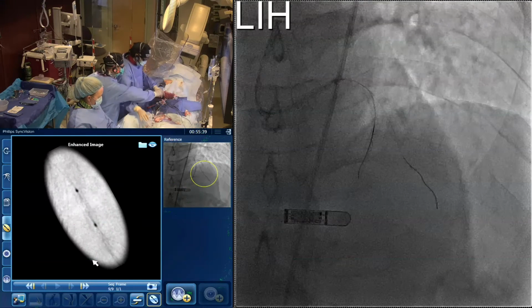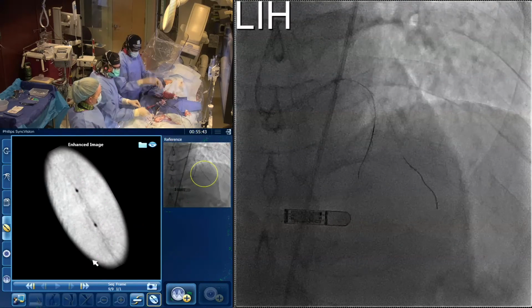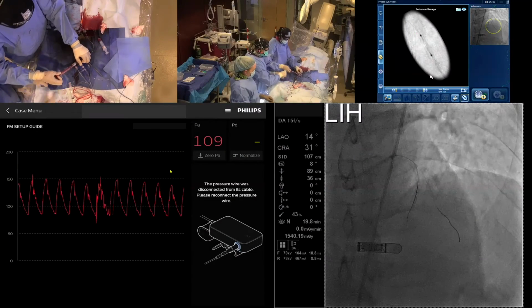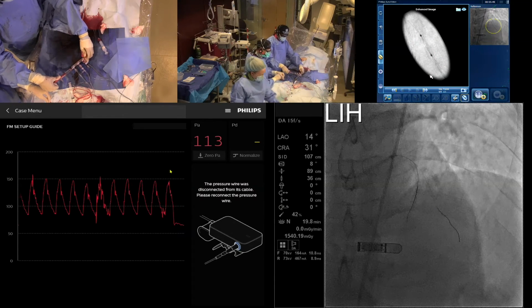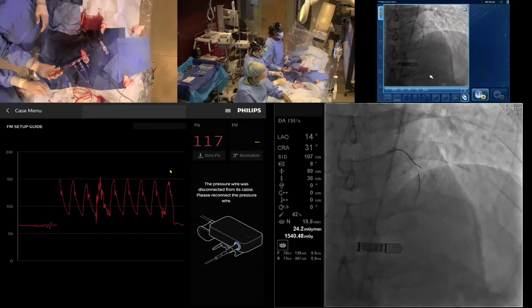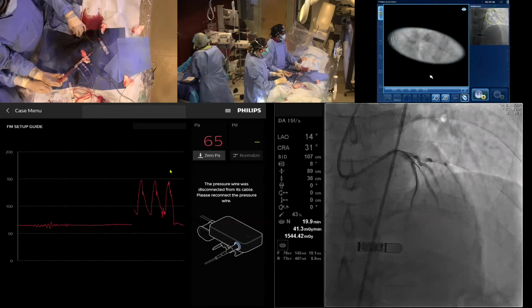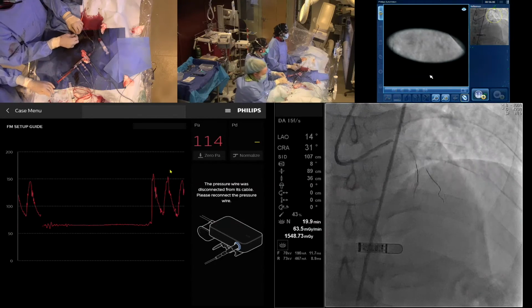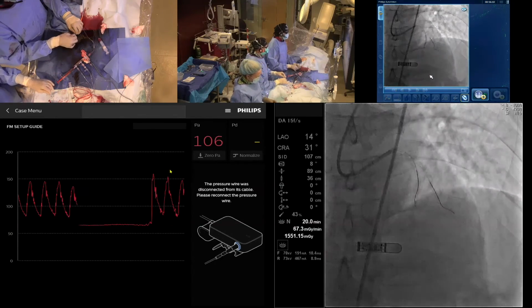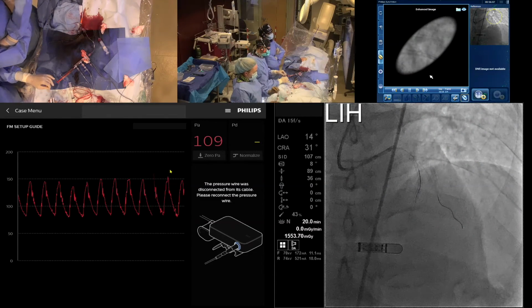All right, let's give this a nice little wipe. And let's get this. How's our dicrotic notch? It's good. Maybe we can just flush it a little bit with some saline. I'm going to wipe it dry actually before I connect. Maybe that makes a difference. What helps is to leave the wire. Well, I thought you were trying to do a pullback for me. There we go. Okay. I could have re-equalized. Yeah, I guess you could have.